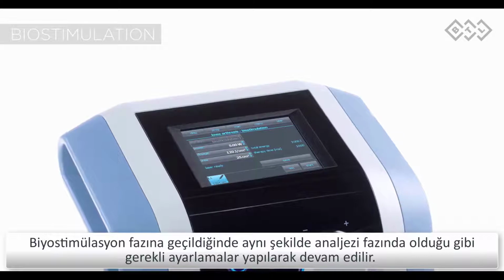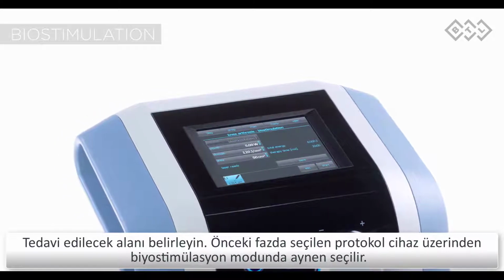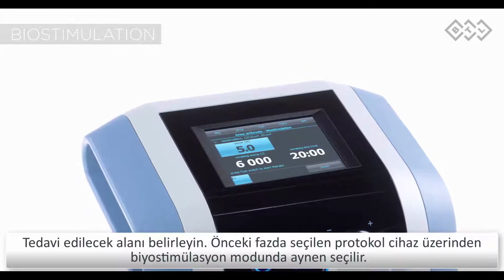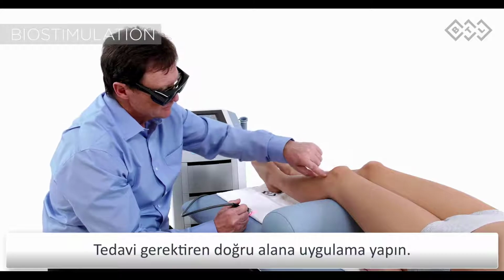Continue in a similar manner when setting the biostimulation phase. Assess the area to be treated. On the device, select the same protocol, this time in the biostimulation mode. Remember to put in the proper area to be treated.